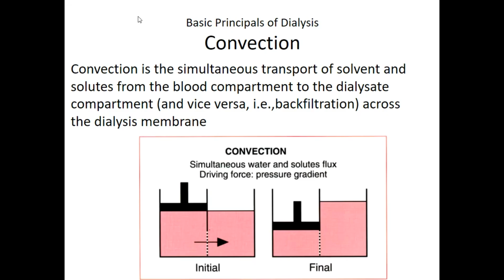The second basic principle of solute removal is called convection. Convection is the simultaneous transport of solvent and dissolved solute from the blood compartment to the dialysate compartment, and sometimes from the dialysate compartment to the blood compartment, and this is called back filtration and will be discussed later.